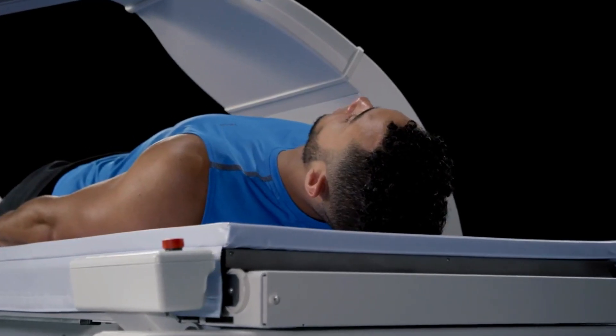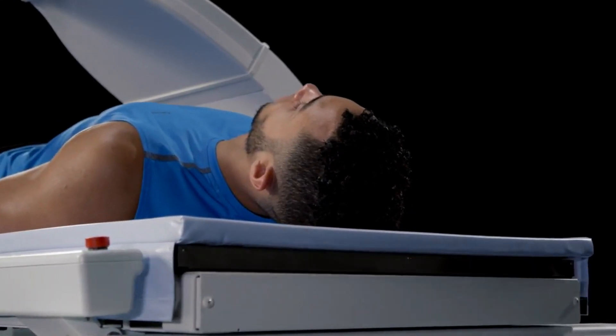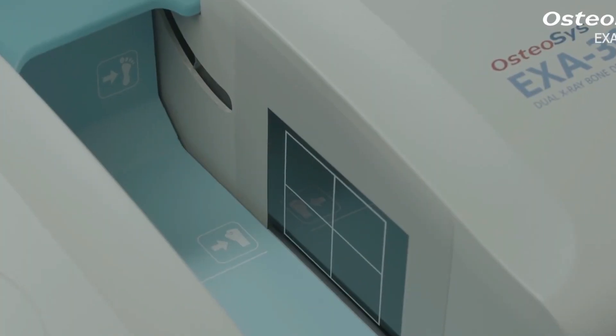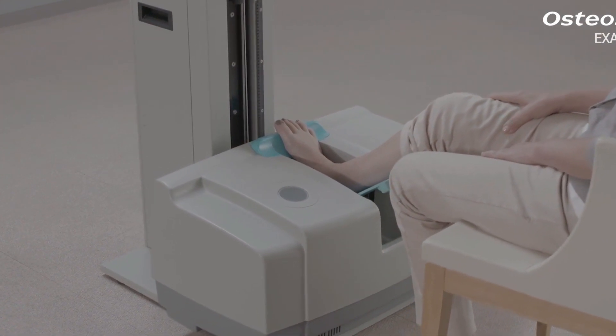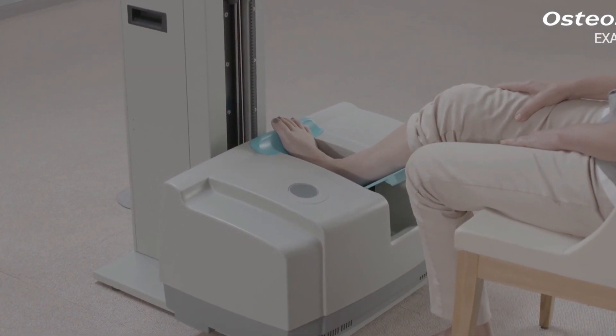Central devices have a large, flat table and an arm suspended overhead. Peripheral devices measure bone density in the wrist, heel, or finger, and are often available in orthopedic clinics and on mobile health vans in the community.